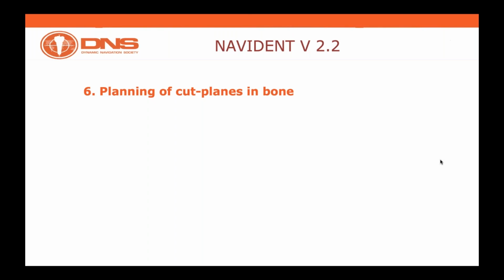Thanks, Dr. Bara, for this, because it's a fait accompli in the sense that dynamic navigation is going to command great attention by the surgeons based on the COVID situation, because of the intrinsic philosophy of dynamic navigation.